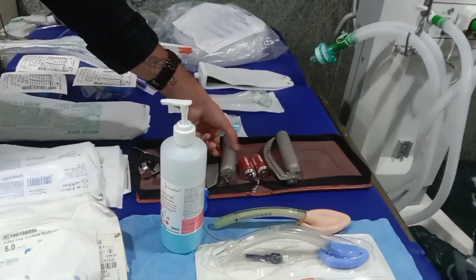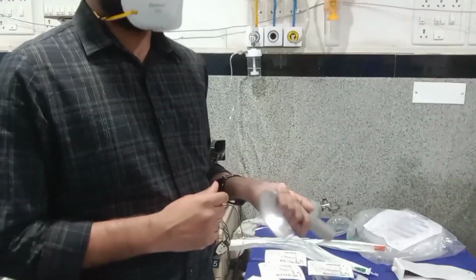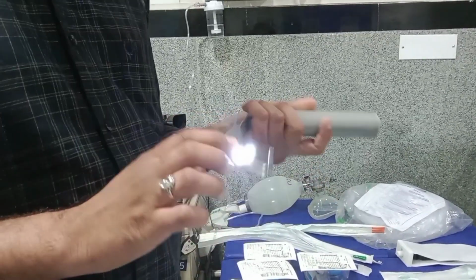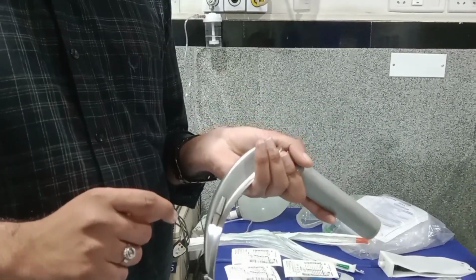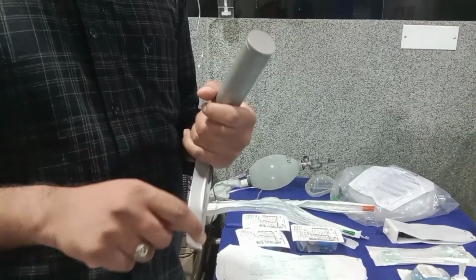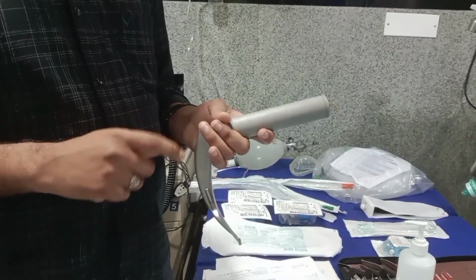By using the laryngoscope, we also should make sure that we have the suction ready. Before using the laryngoscope, make sure the bulb is lighting. Once we check the laryngoscope, we put it on the right lateral side, and we make sure that the tongue comes behind the laryngoscope blade. So we proceed slowly into the oral cavity with the laryngoscope.